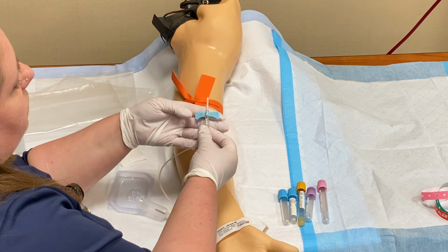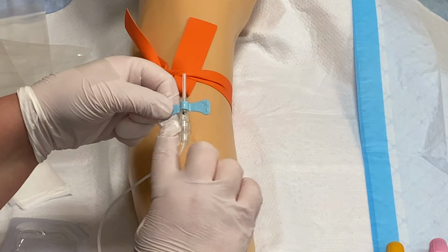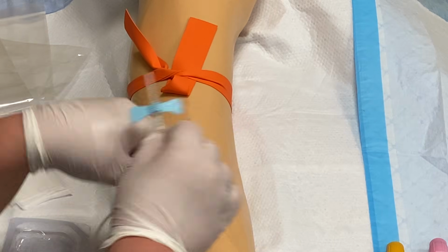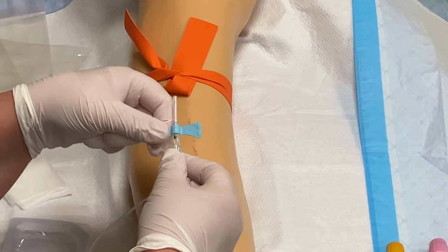I'm gonna look at my needle. This is my butterfly. I wanna make sure that I can see the gauge written on the wings. The black button that retracts the needle should be facing me, and the wings should be flat side towards the patient. That way I know when I take this needle off, the bevel is going to be facing me.